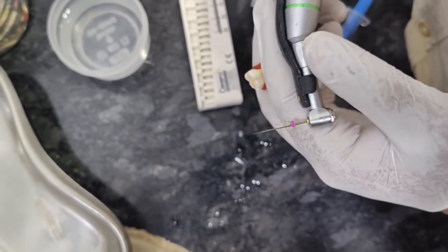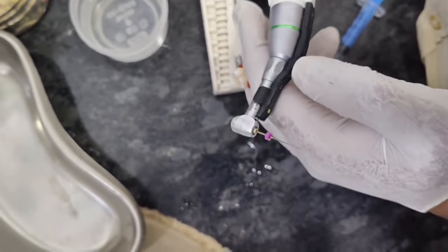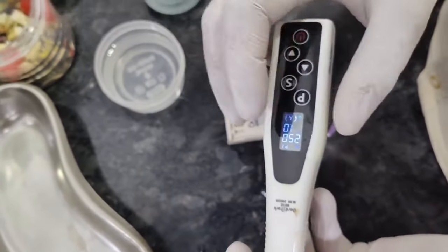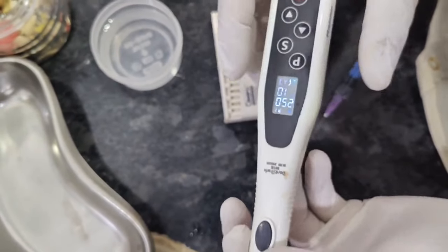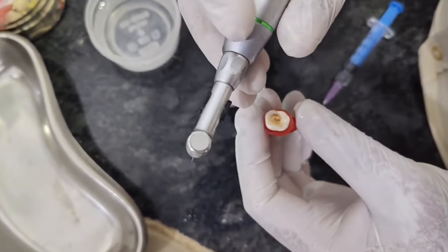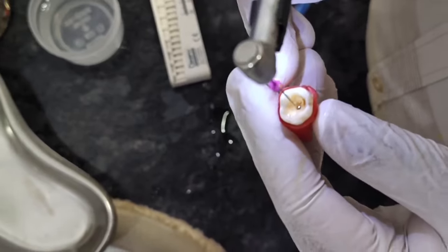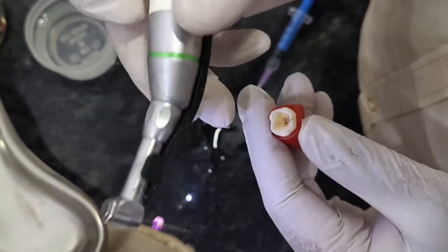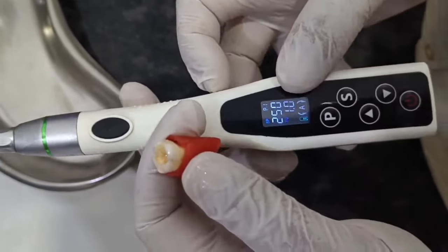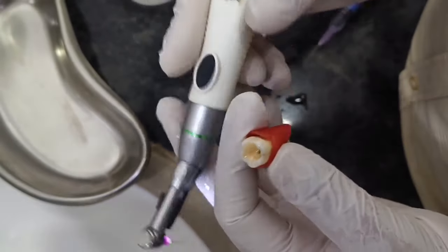So after using those files, I use this path file. This is a path file of Woodpecker company, and this is the endomotor I am using. I am setting the RPM at 250 and torque at 1. For beginners, you should reduce the torque and reduce the RPM to, I think, 200 you can take, or 0.6. You can see the RPM is 250 and torque is 1. I have already shown the settings of the endomotor in the last video.